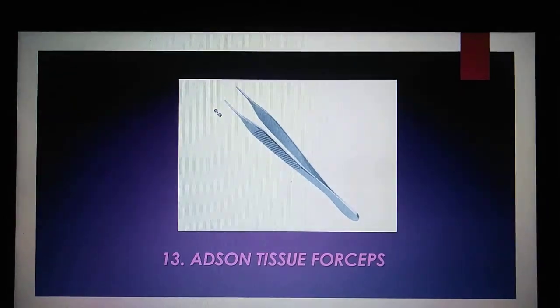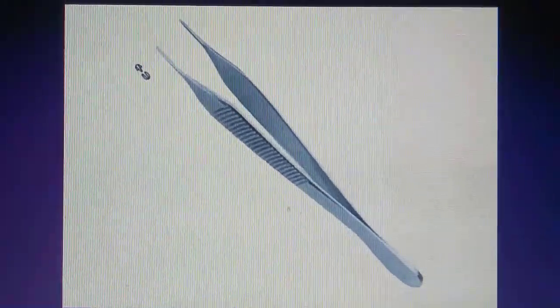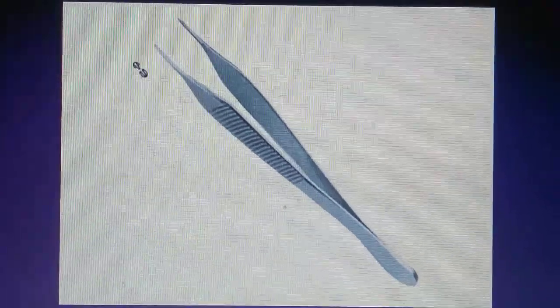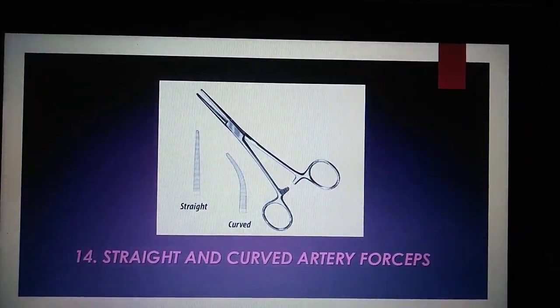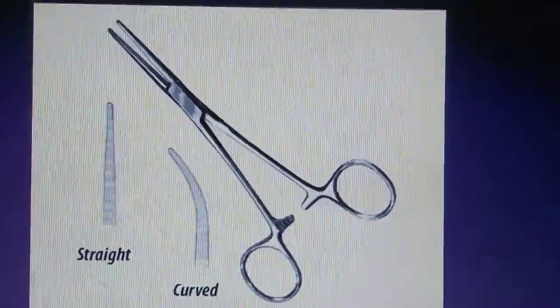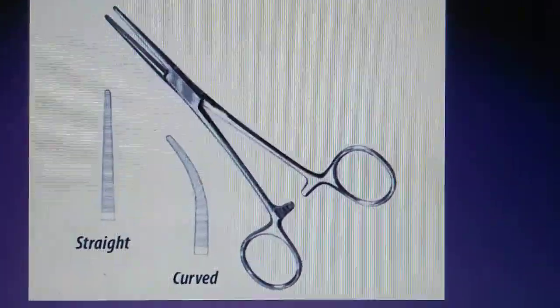Adson Tissue Forceps are used for holding and manipulating delicate tissues. Straight and curved artery forceps are used as a hemostatic agent to cease blood flow in vessels. They may also be used to grab and maneuver delicate tissues.